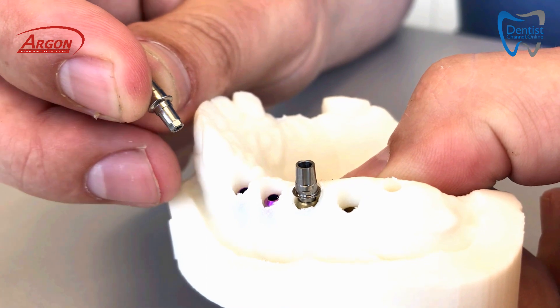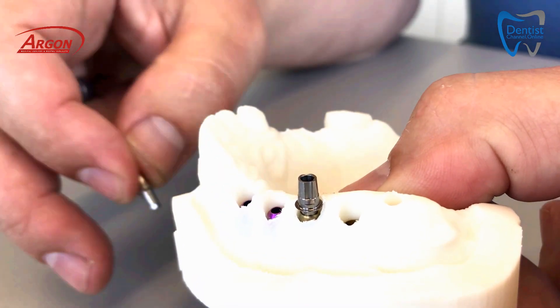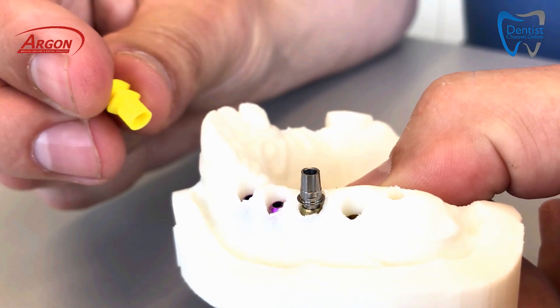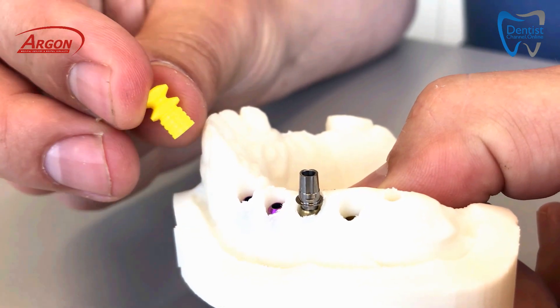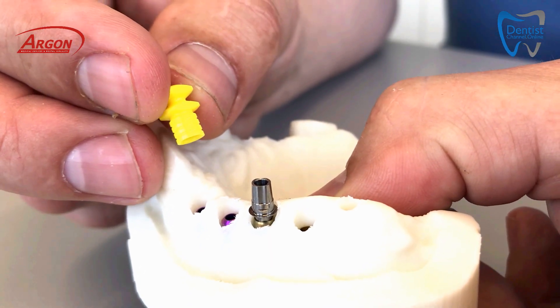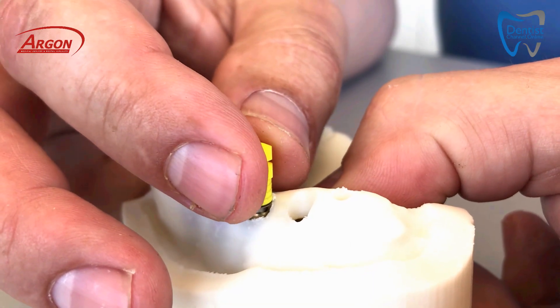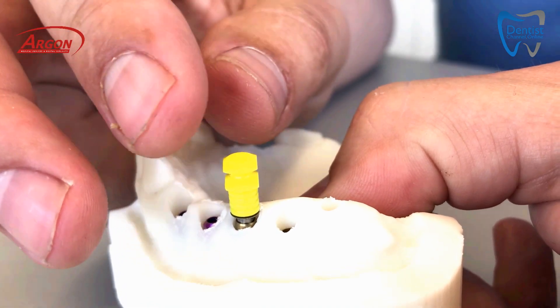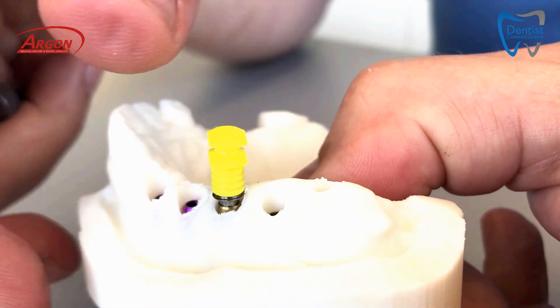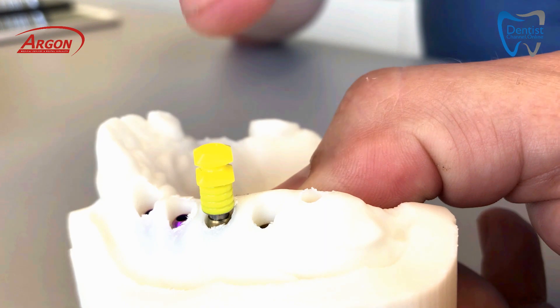After you have done the re-entry and placed either the temporary abutment or the permanent EAK abutment, you can do the impression directly over the abutment using a tool that may already be familiar — it's the same tool used for the closed tray impression. You place it over the abutment; it can only turn in two directions, 180 degrees apart, and you will hear a firm snap when it's in position. That's when you take the impression right on top of the abutment.